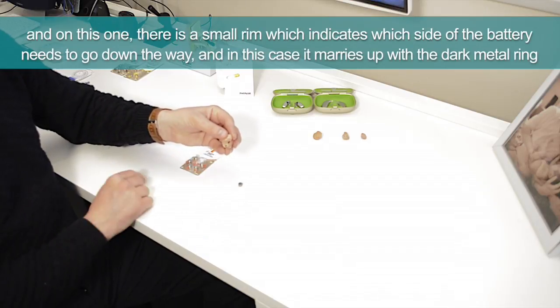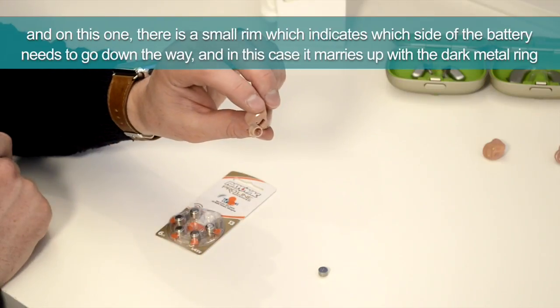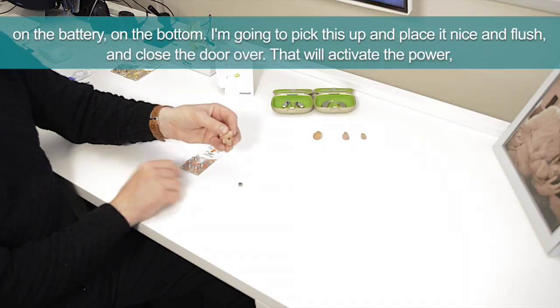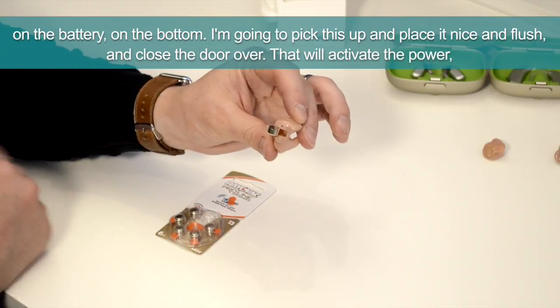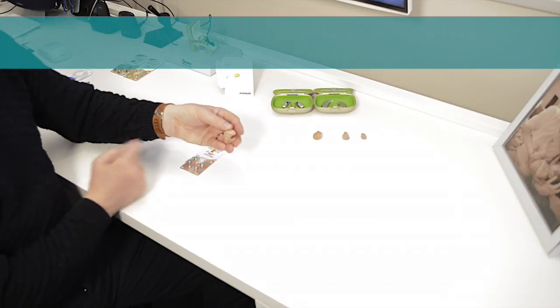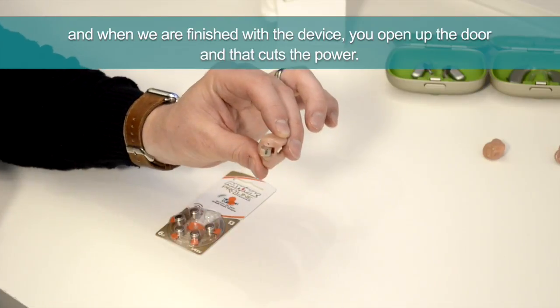small rim which indicates which side of the battery needs to go down the way, and in this case it marries up with the dark metal ring on the battery on the bottom. I'm going to pick this up, place it in nice and flush, and close the door over. That will activate the power, and when we're finished with the device, you open up the door, and that cuts the power.